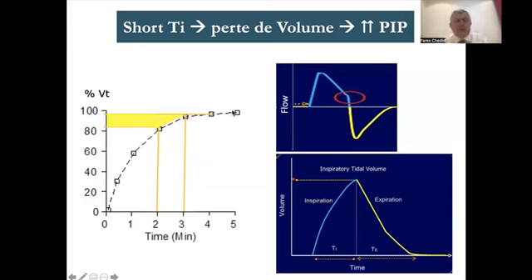in that flat area, and at that flat area the volume is flat, so increasing the I time will not make any difference to the VT because we are in the flat zone. But if you shorten the I time from 3 time constants to 2 time constants, look at the amount of volume you lose. You see this amount of volume you lose in the volume graph.